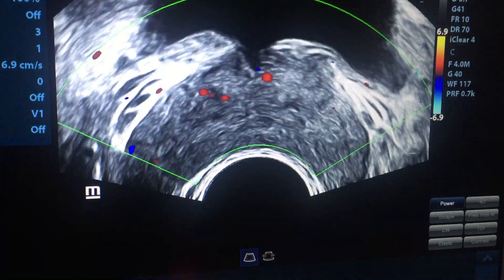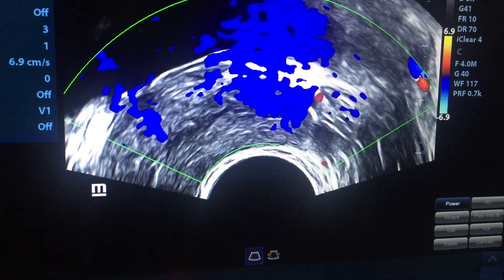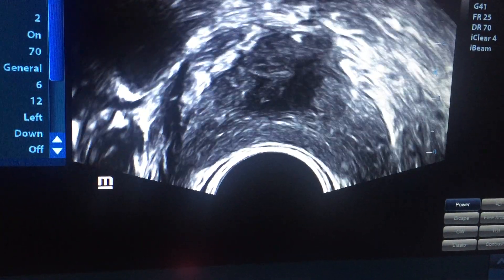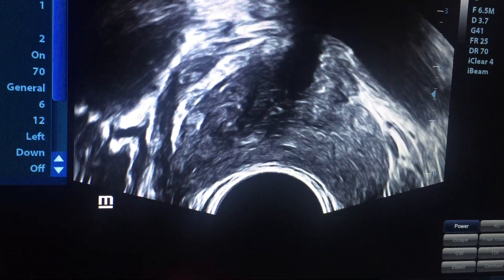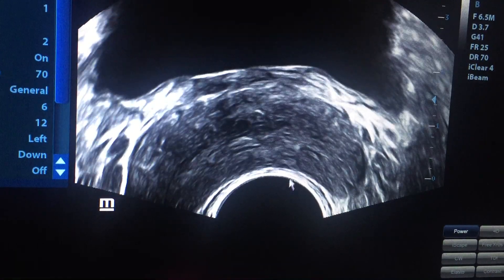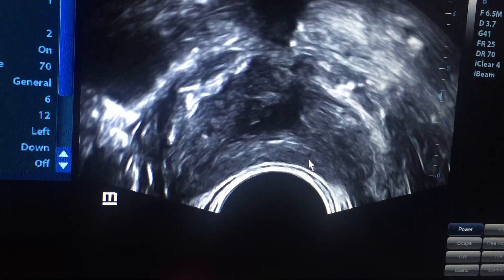Also on the other side — is there obstruction? No, no obstruction. We are checking a male patient with infertility. We are concentrating on the central area because we are checking for the ejaculatory duct region.